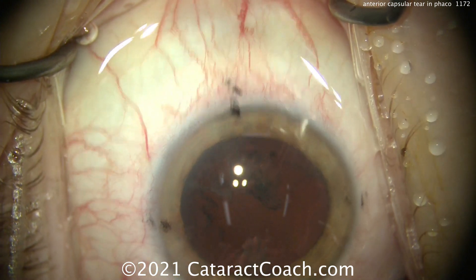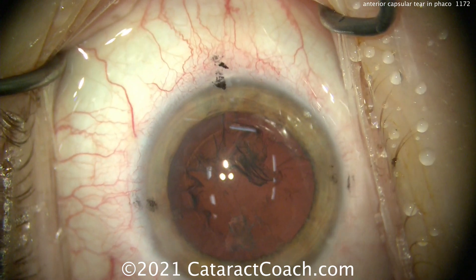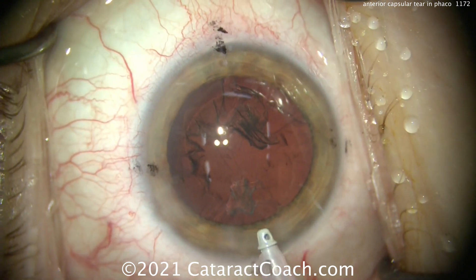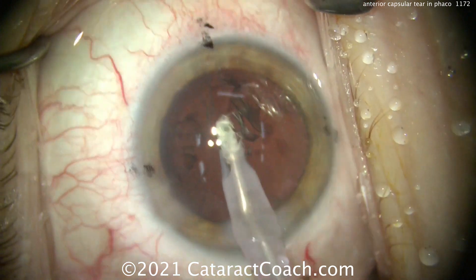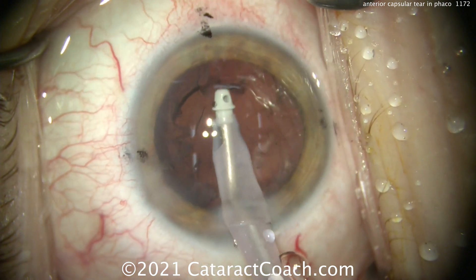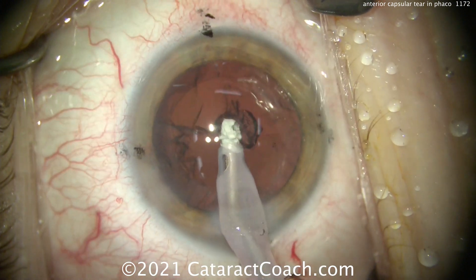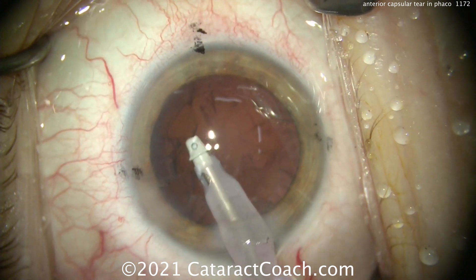You can see it on the video in retrospect. At the time, it's a little bit harder to notice. So adjusting the red reflex — not sure if we have a tear there just yet, but you're going to see it revealed once we remove the cortex. Going inside the eye here, and I'll start removing the cortex in our typical manner. And then it'll become obvious that we have a rip there, on the right-hand side of your screen, which is the patient's inferior. Now we see there's a rip.